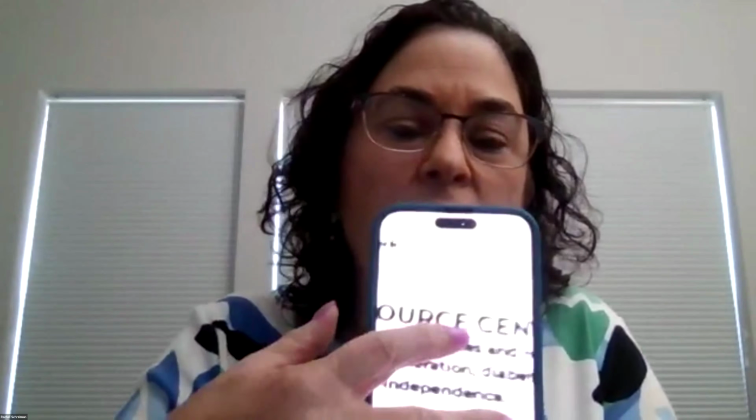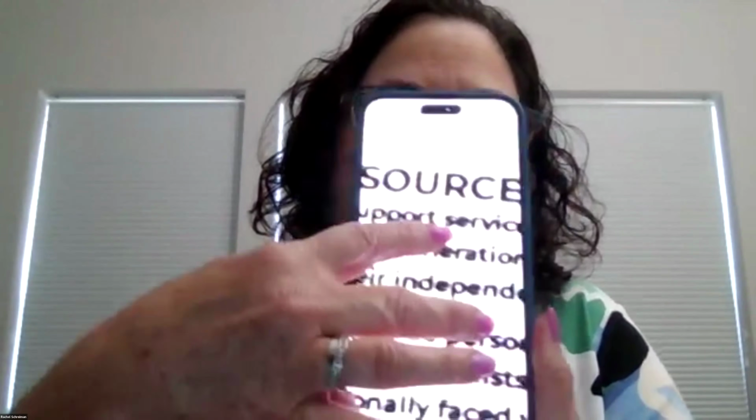When you open it up, you can magnify in and out in a live mode. You can also snap a picture so that you can then see it, zoom in, and you can move your screen closer to your eyes and be able to zoom in and out. This is how I read a menu at a restaurant as an example.